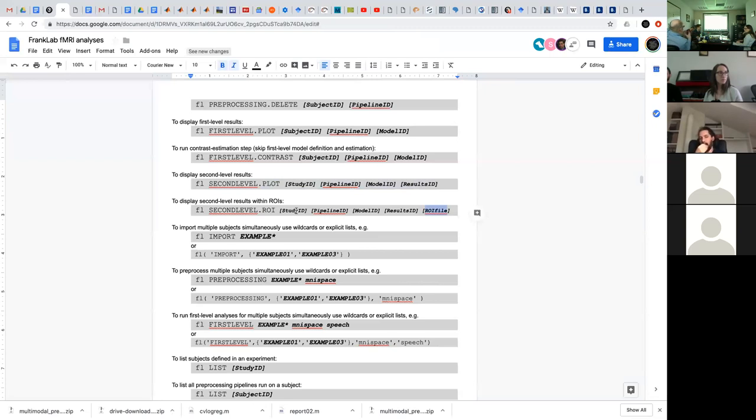But if you have ROIs that you derive from the structural scan, and you want to put them all in the same template, in some common space, it seems like the best option would be MNI 152, because 152 and 305 are not the same. There are some differences. Well, but you know.